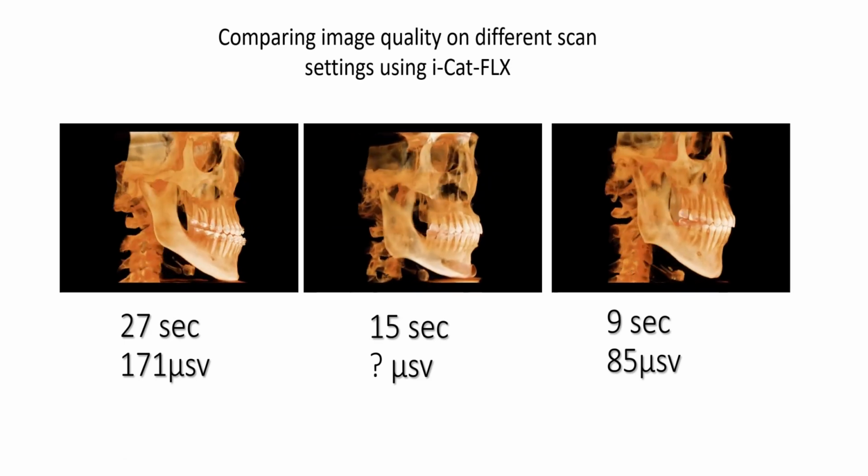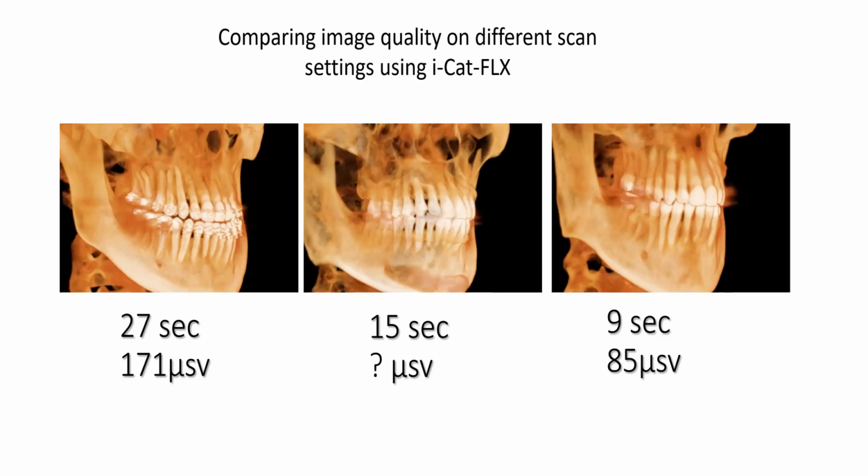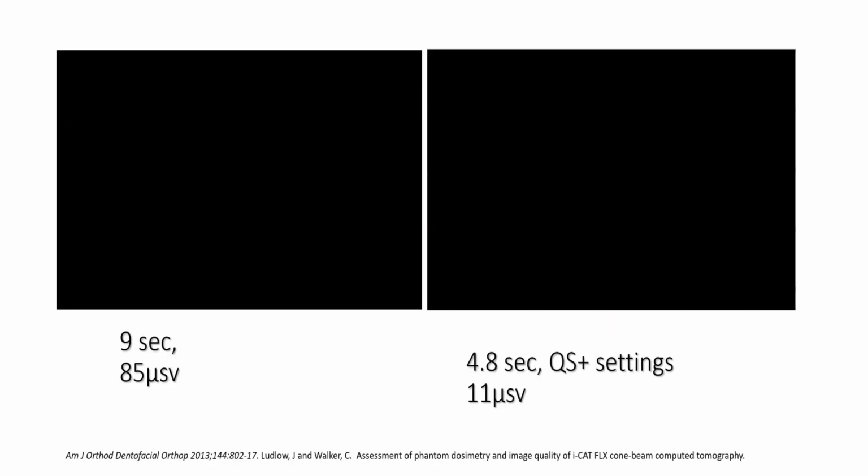So why would you want to do a 27-second scan when you can do a 9-second scan at lower dose, right? It's diagnostic enough, okay? Now let's compare when the iCat Flex came out. I was really excited about this because we see children, right?